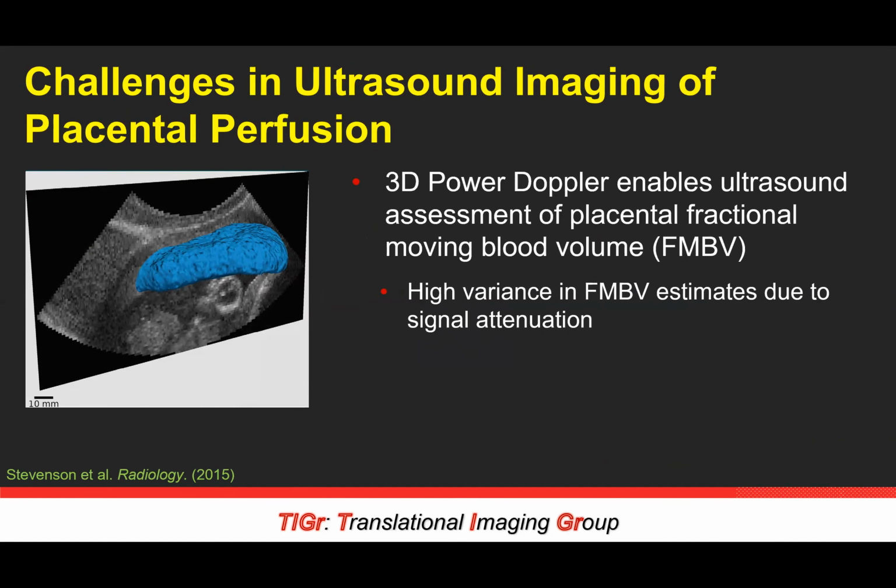So why am I doing this? And this is an extremely important question, because a question many of you might be thinking about right now is, why do we even need to use contrast enhanced imaging? You have ultrasound techniques and you have normal conventional MR techniques for being able to assess the health of the placenta. So why are we interested in contrast enhanced techniques?